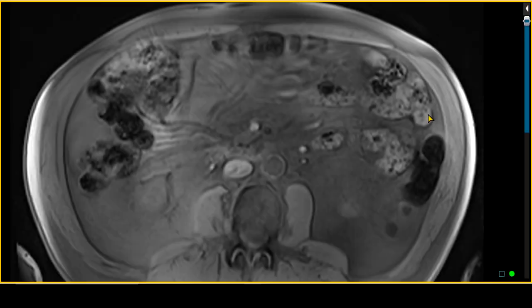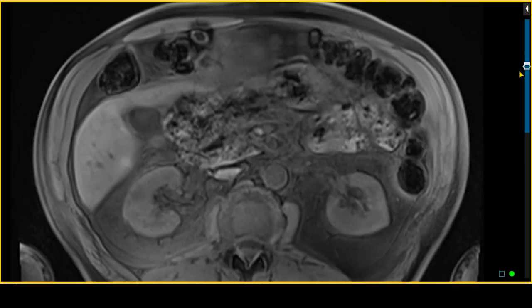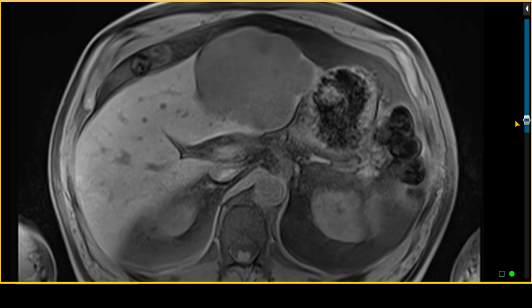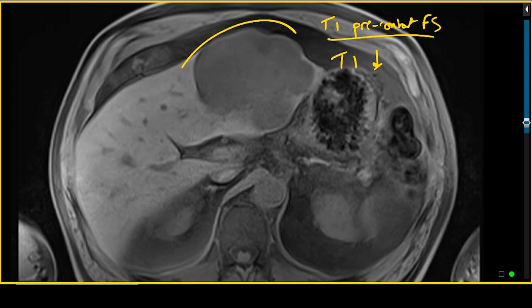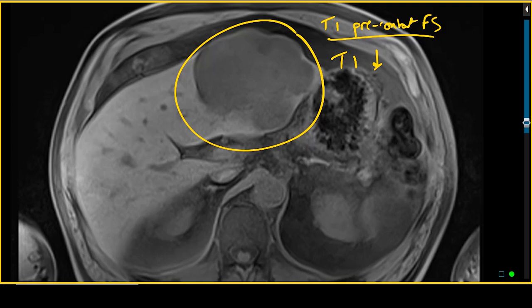The next sequence is the T1 fat-saturated pre-contrast image. On this sequence, the lesion is predominantly T1 hypo-intense — you can see this large lesion here. Interestingly, if you look critically, those areas that were slightly brighter on the T2-weighted images have relatively darker signal on the T1-weighted images compared to the remaining portion of this mass.